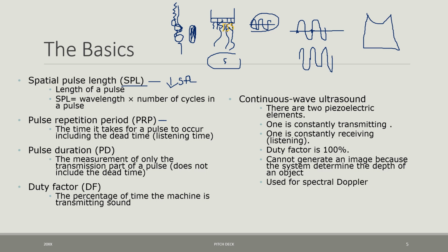And that wait time between the time it sent its first pulse and the time it sent its second pulse is also going to affect the wait time between the first image, that flicker you will see. So if you remember ever watching an old movie or going to the theater, before the picture show started, you would see a lot of flickering as the tape reeled. Well, that's because there was a delay in between seeing one frame to the next.